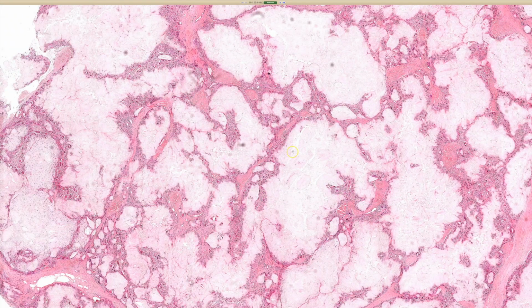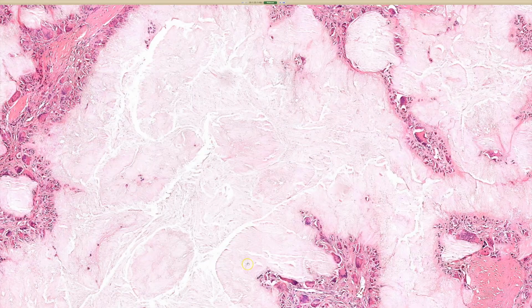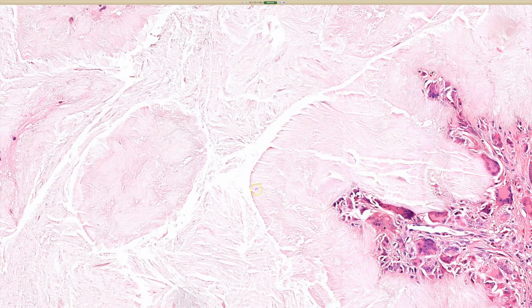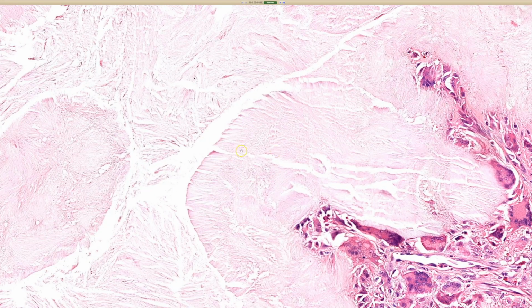Like you said, I think of these as big, puffy, pink, or sometimes they look blue. It depends. This is an old faded slide, but it also depends a little bit on the H&E staining. Sometimes these aggregates where the gout crystals used to be are pink, sometimes they're bluish pink. They remind me of clouds, kind of fluffy. And then when you go closer, you often can see the outlines, the spiky, long needle-shaped spaces where the crystals used to be, and then they dissolve away.